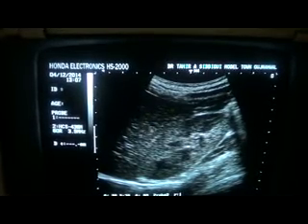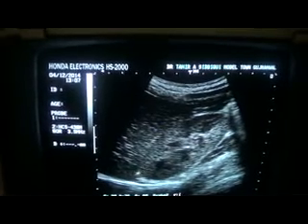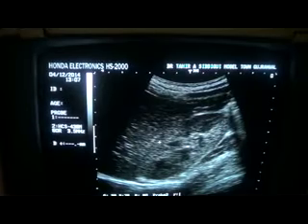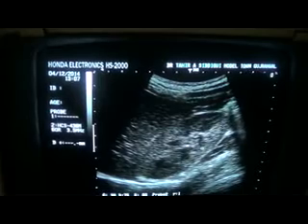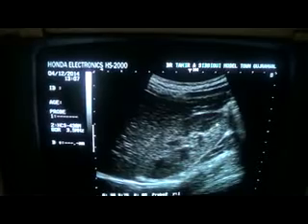Now in this case, the liver is normal, the diaphragm is okay, right diaphragm is showing no fluid about the diaphragm in this scanning plane, and then we see that the echogenicity of the parenchyma is raised in this angle. This is the liver and this is the right kidney. This is point number 2.